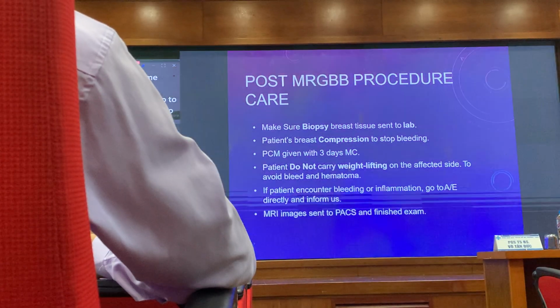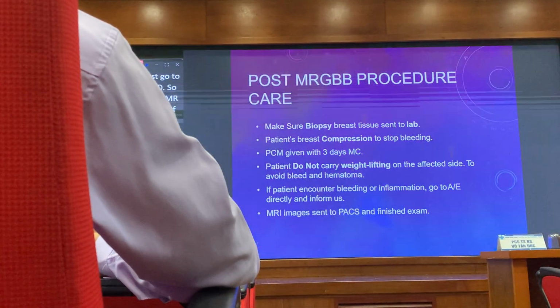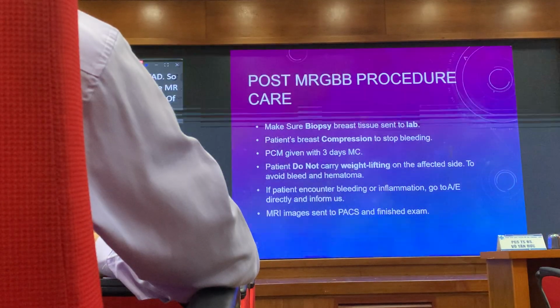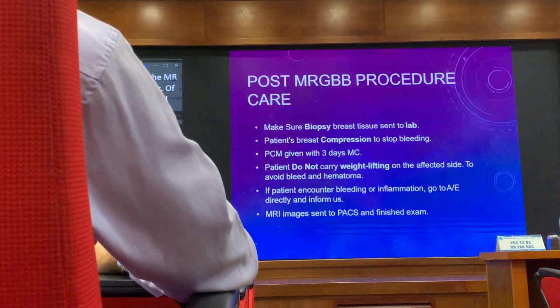And all the MR images will be sent to our PACS for saving and also for radiologists and doctors to review. Okay, that's all for the MR-guided breast biopsy. Hope that it will be beneficial to every one of you. Thank you.